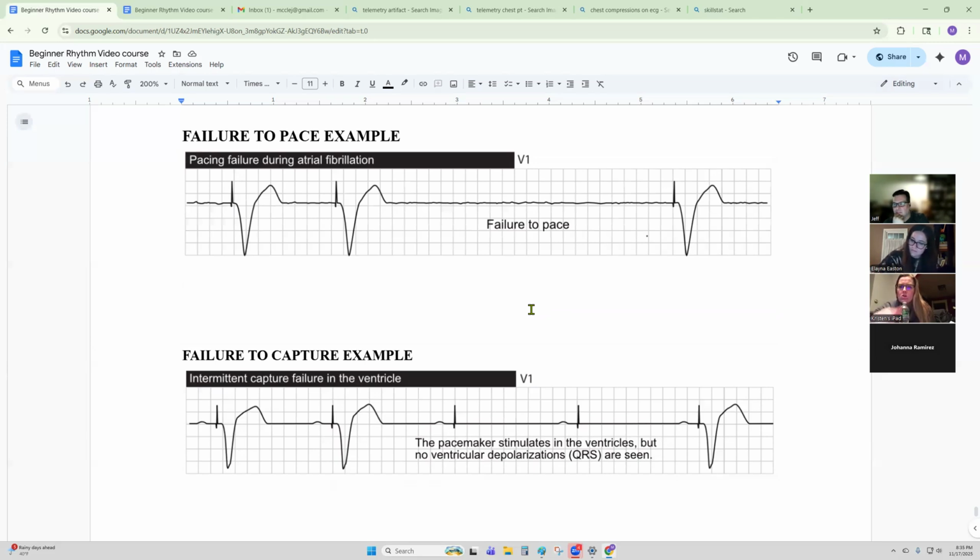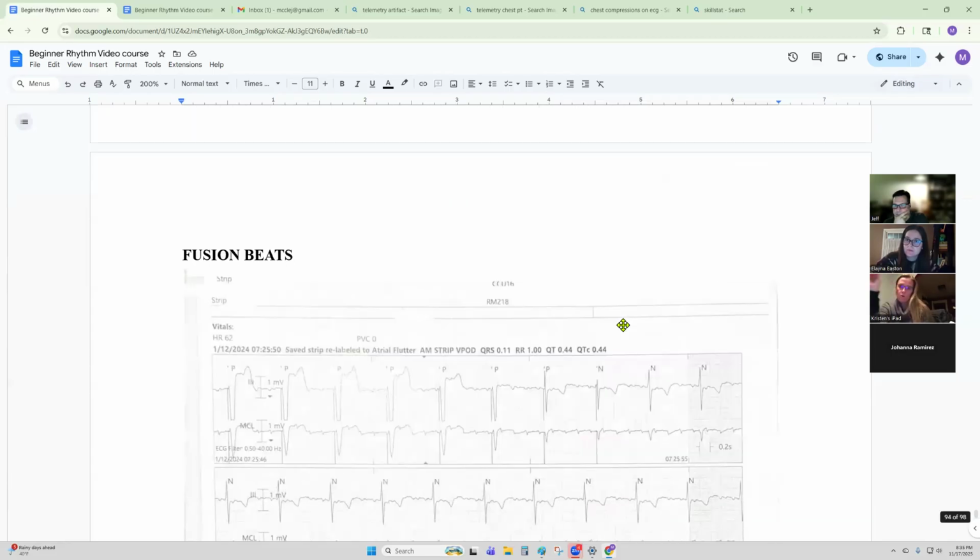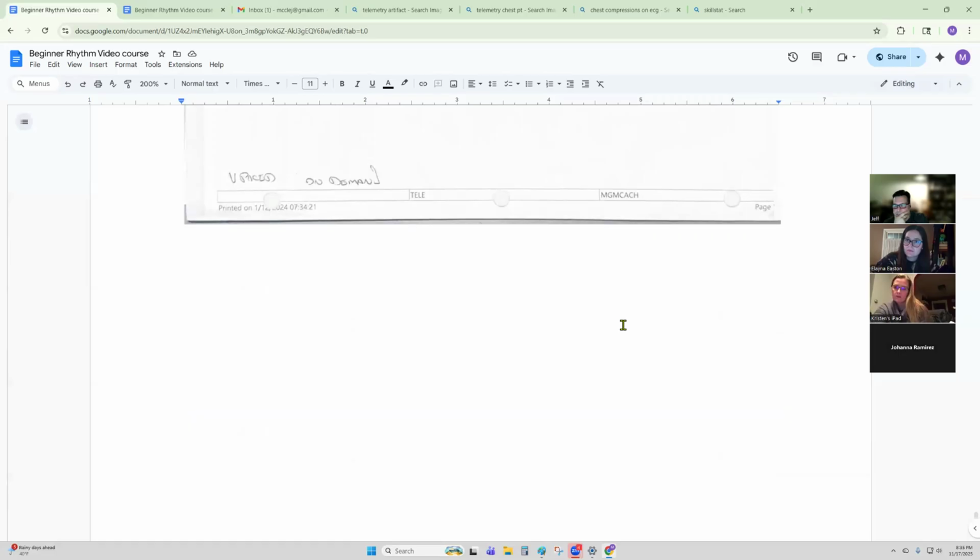Kristen? Oh no, I was thinking of one I had too with the T wave. It just kind of widened out, and it worried me because I had seen one previously with the QRS widened right out, and that's when the patient basically went to CCU and there was something going on. Mm-hmm. So I don't know. I don't know what to tell you on that one.